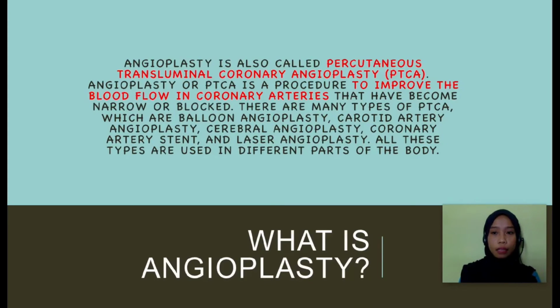There are many types of PTCA, which are balloon angioplasty, carotid artery angioplasty, cerebral angioplasty, coronary artery stent, and laser angioplasty. All these types are used in different parts of the body.